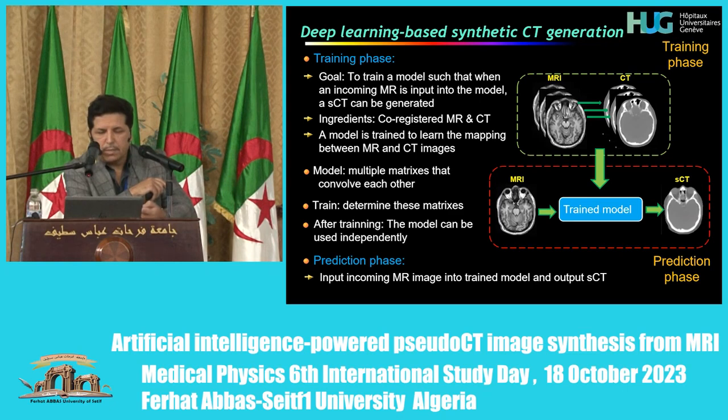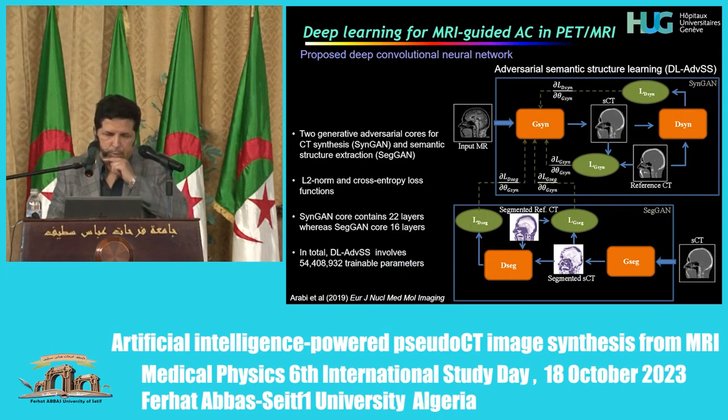And then you've got the second step, which is the prediction step, where we predict pseudo-CT from the MRI without actually using the patient's CT image. And one of my PhD students developed the model that you see here. So there are two major components.